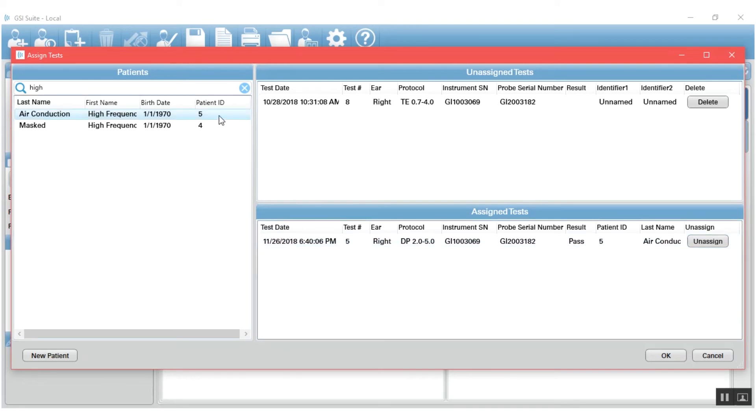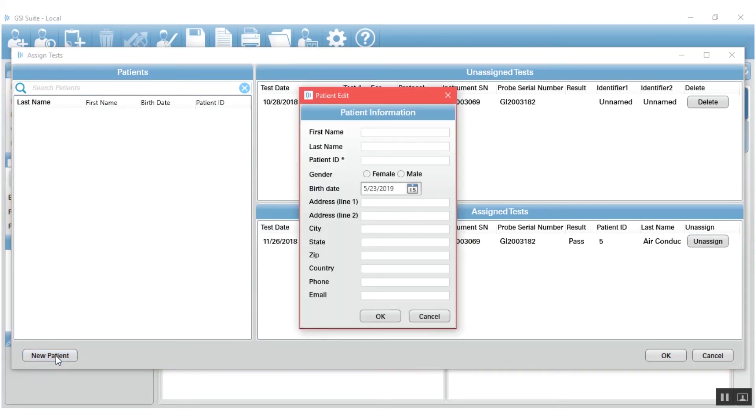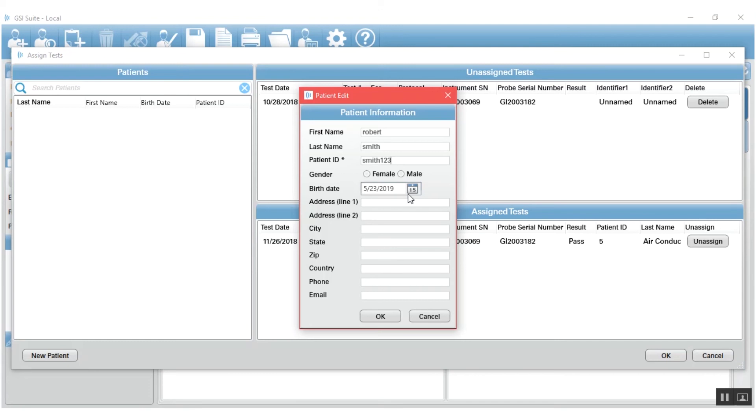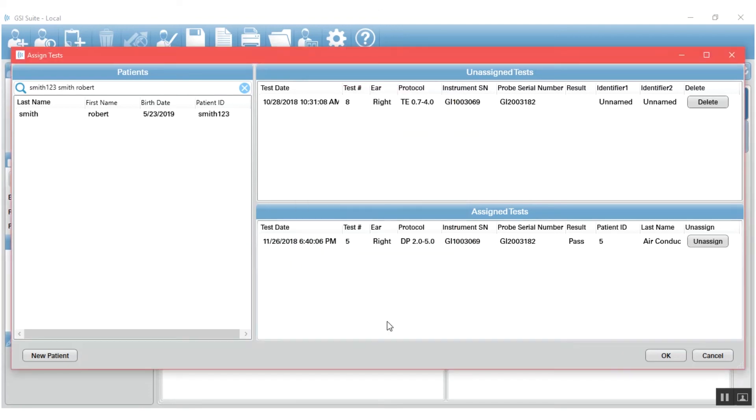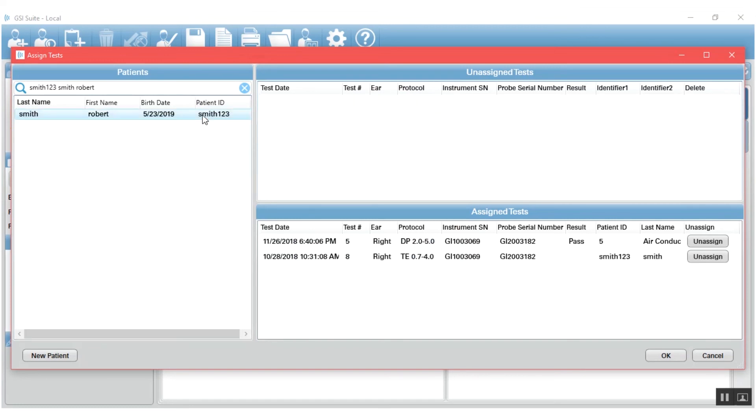The next thing I'm going to show you is if you don't have that patient in the database, you can go to new patient and you can type in a new patient with a patient ID, of course, hit OK, and then that patient will appear in the patient window and you can drag and drop the information there.